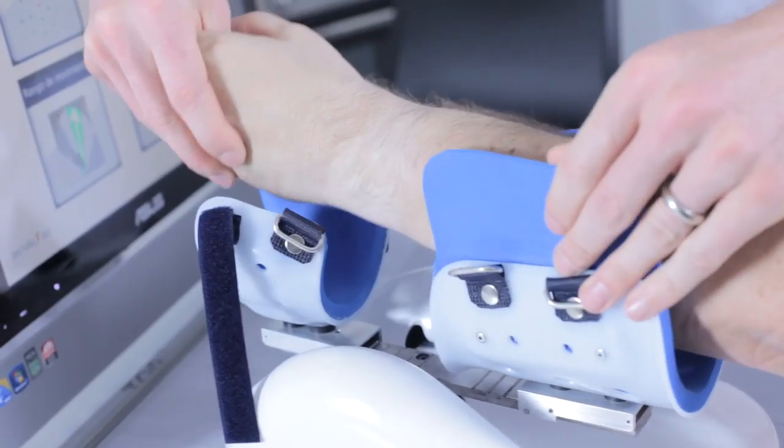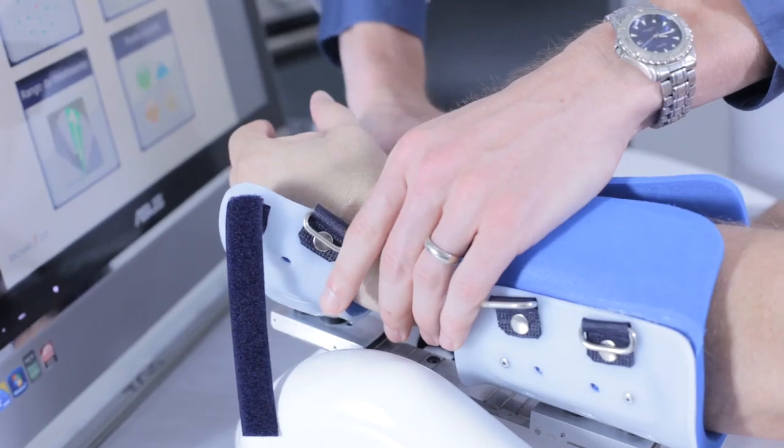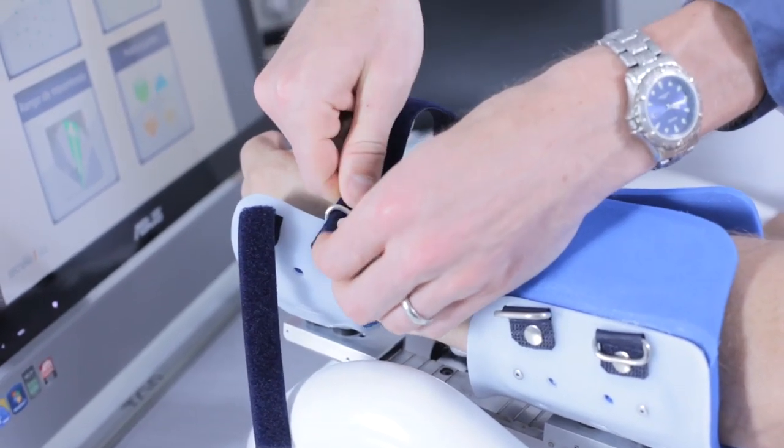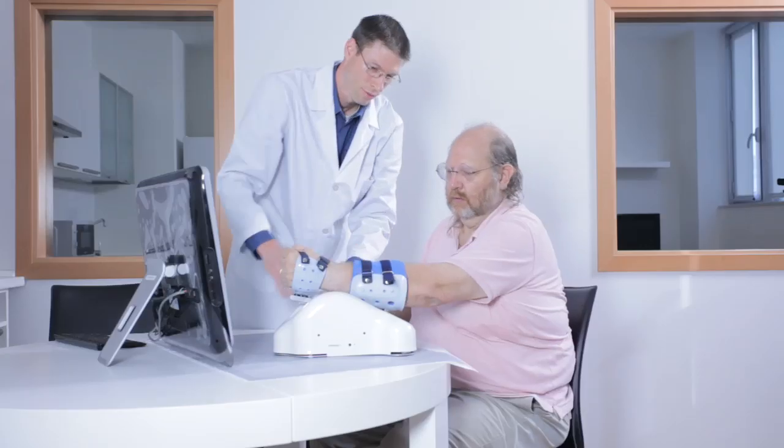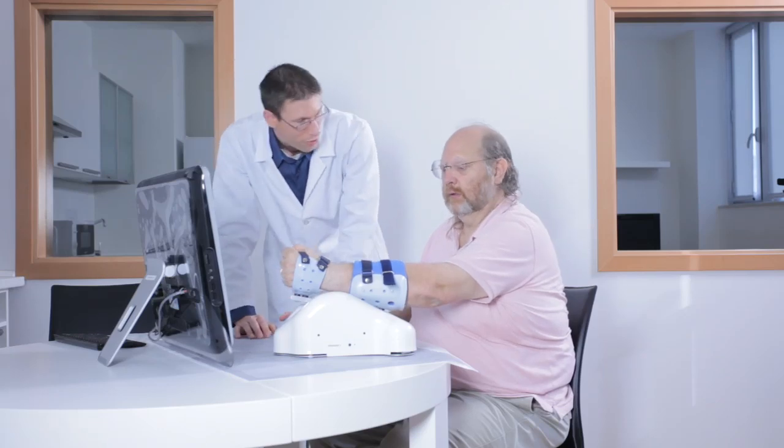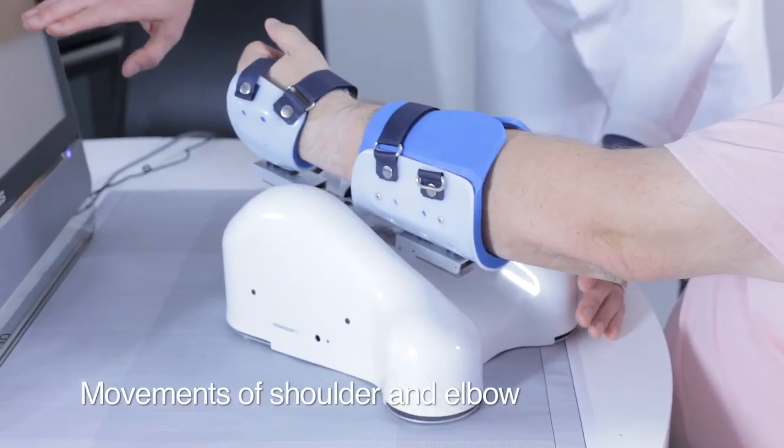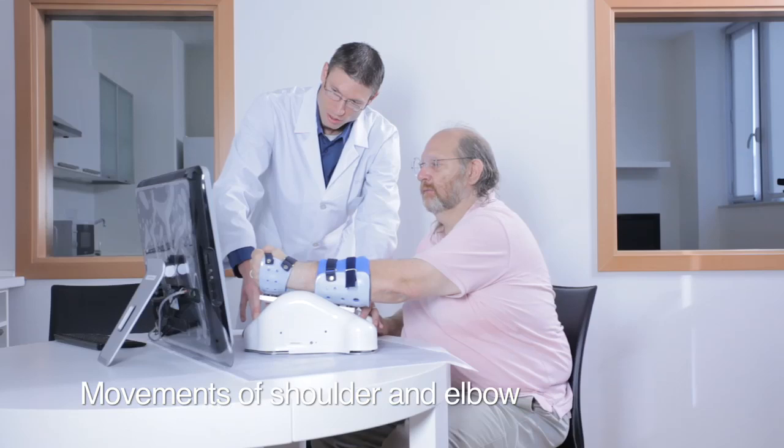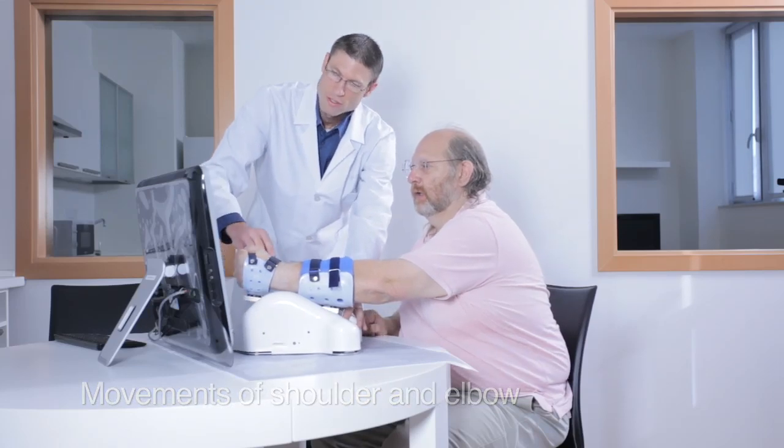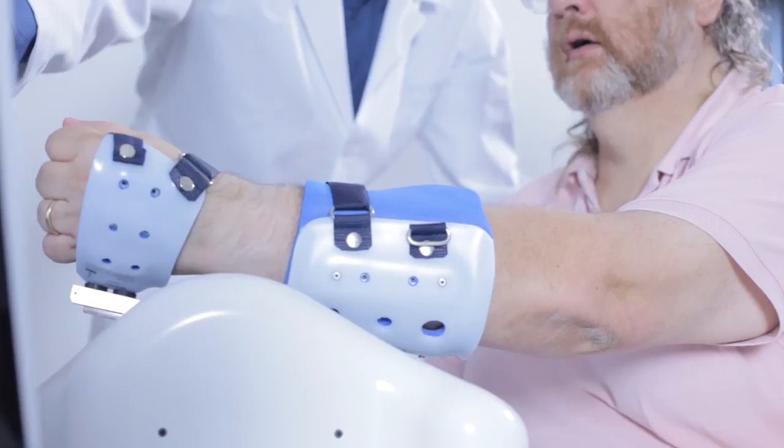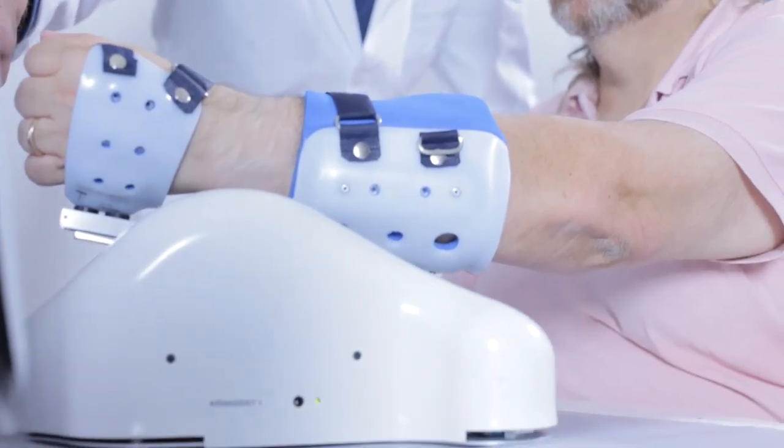The patented Arm Assist system uses a mobile base module to support and measure user interactions during active or passive reach movements of the shoulder and elbow in post-stroke arm training. Add-on modules can extend the training to the level of wrist and fingers.